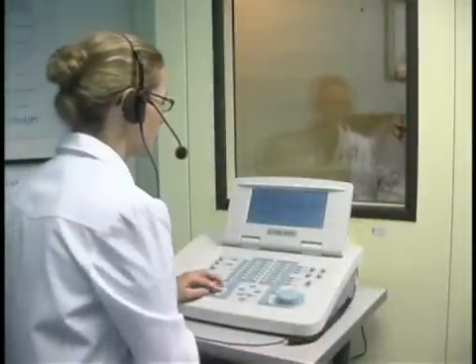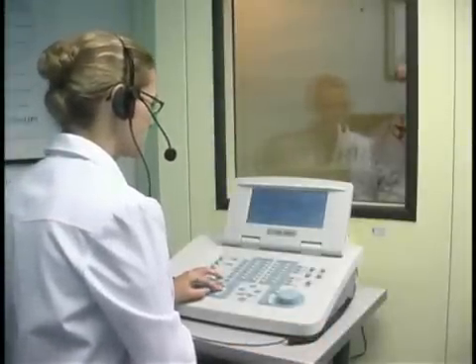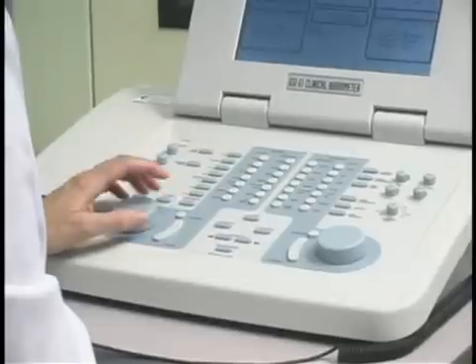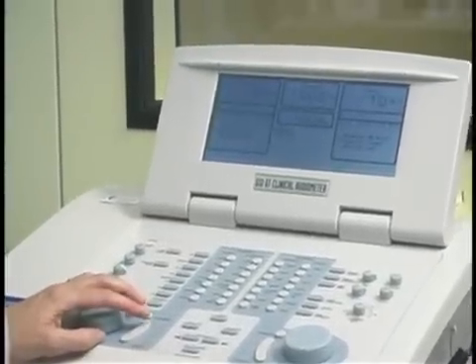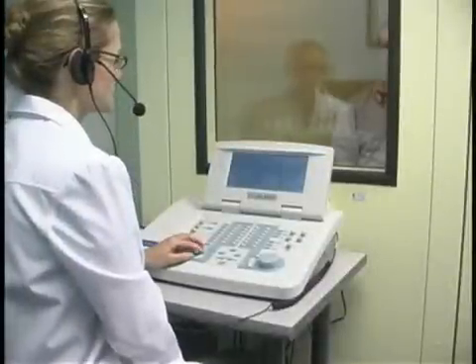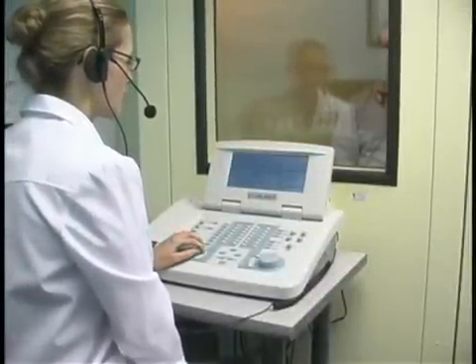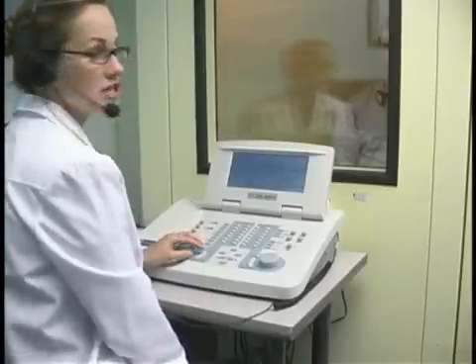I'm starting at a level where I know he can hear, and then I go down in steps of ten decibels each time. Each time he responds I go down by ten decibels again until he doesn't respond. When he doesn't respond, you go up in steps of five. This is called a bracketing technique — we're trying to determine the softest level that he can hear at least two out of four times.